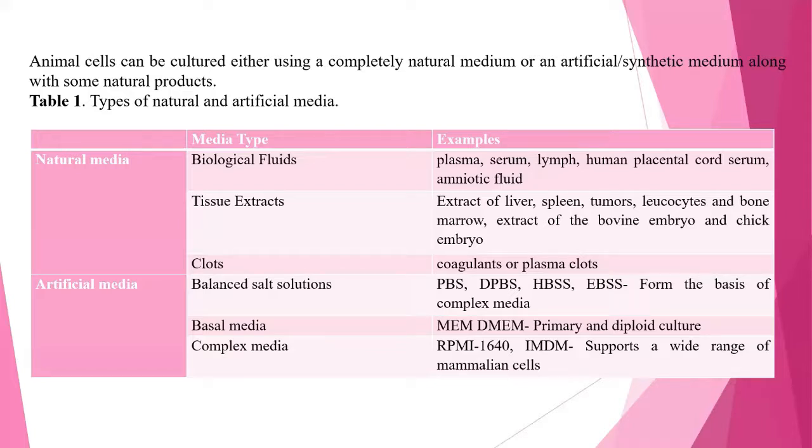Okay, so even now, you know that serum is an important component of most of the media. I told you that serum itself is enriched with different types of nutrients and different types of growth factors. So in case it's a serum enriched media, then the addition of supplements will be very less when compared to the serum free media, which requires more types of supplements and more types of nutrients which have to be added to the cell culture media.